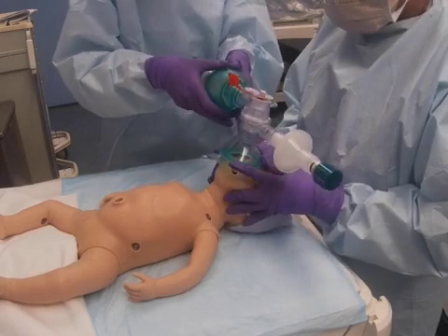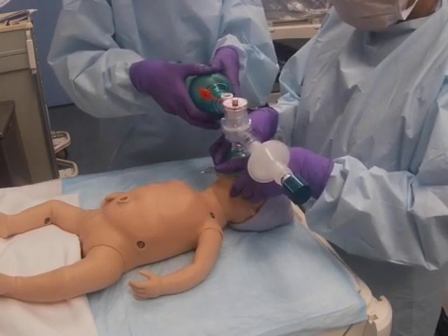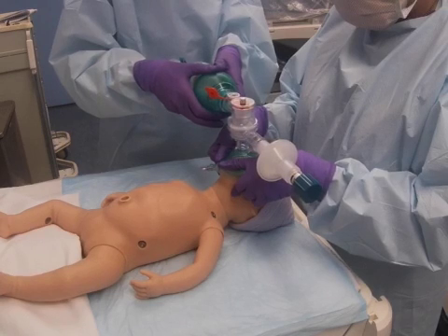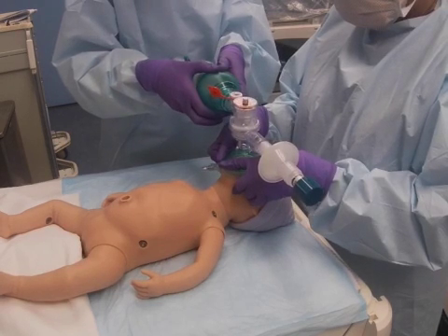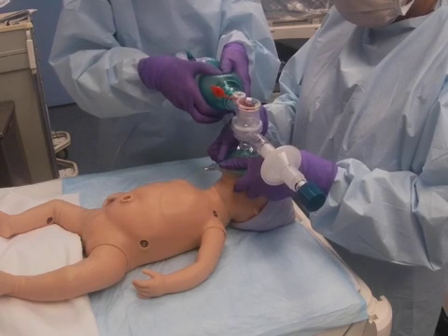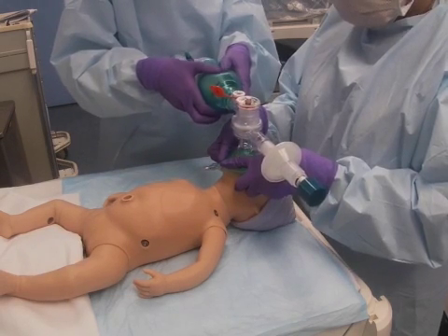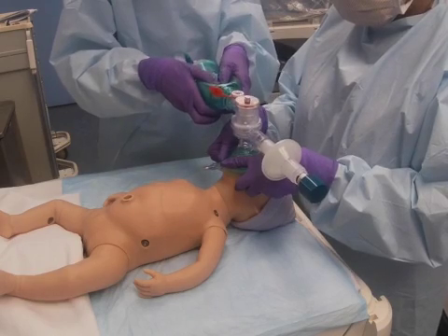To ensure proper seal when delivering positive pressure, a two-person bagging technique is recommended. One person ensures mask seal, and the other provides positive pressure. Avoid using the T-piece resuscitator to prevent non-disposable device contamination.